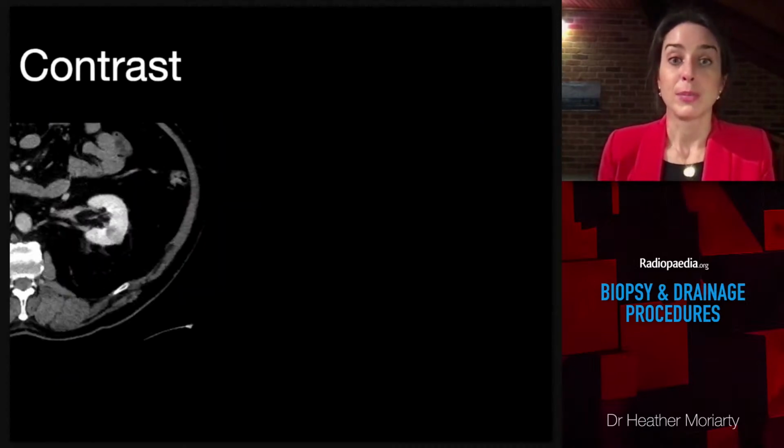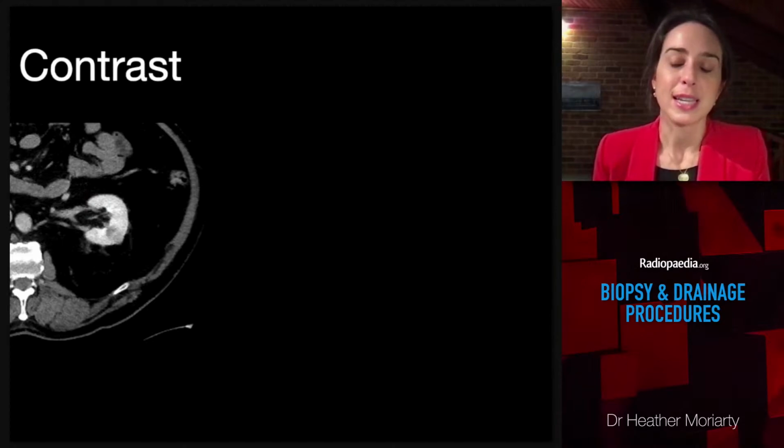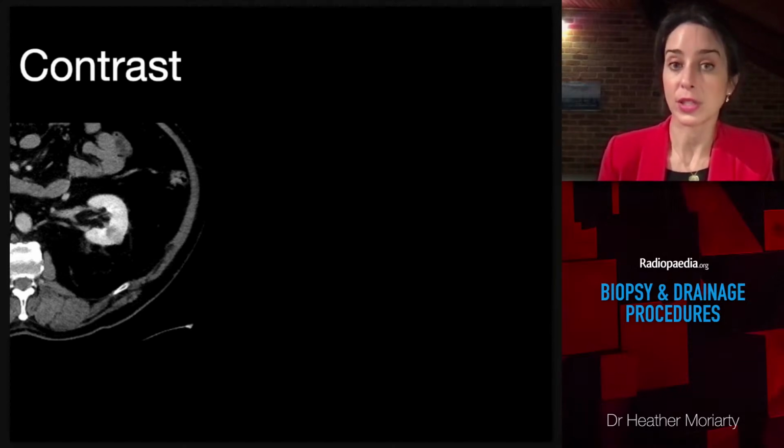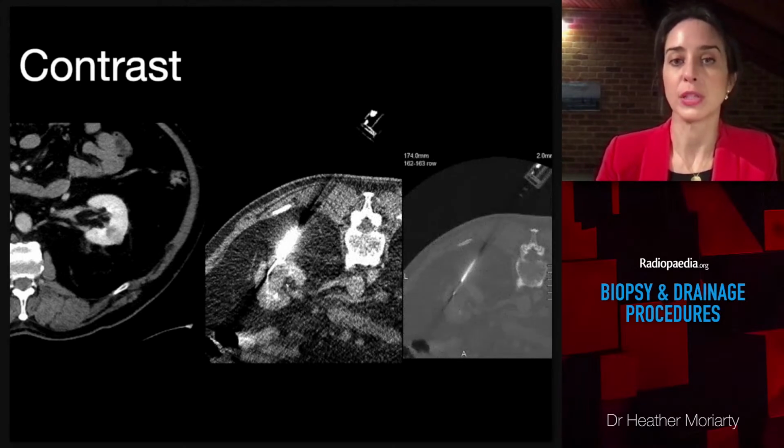It can be helpful to plan based on non-contrast and save the contrast injection as a late step. This renal lesion was difficult to see without contrast, so here I gave contrast after the local, in biopsy mode, so there was still contrast enhancement of the structures while actually biopsying, which can increase confidence with needle placement.